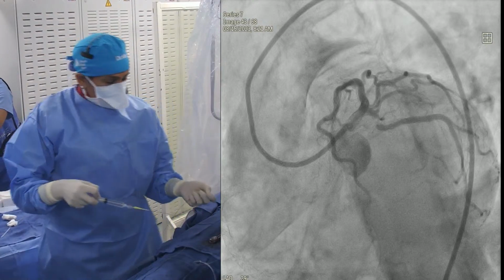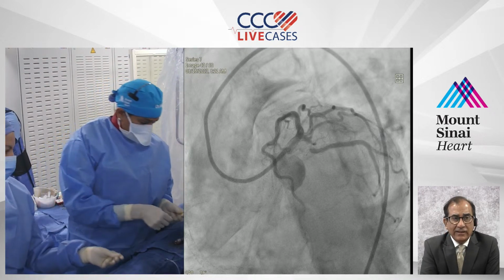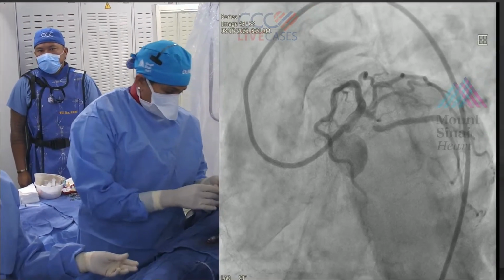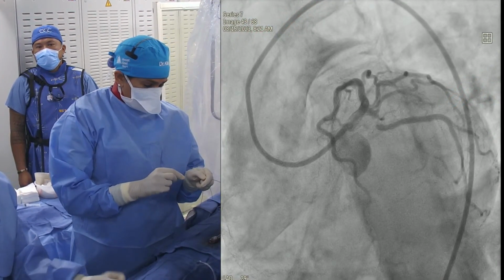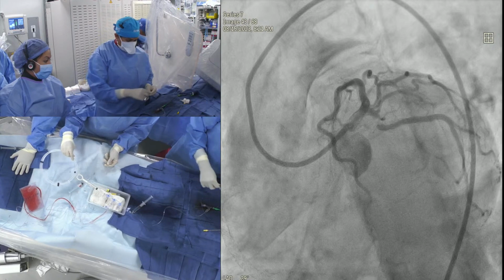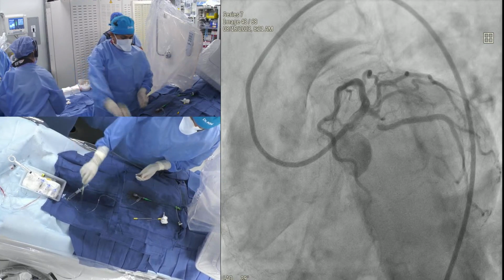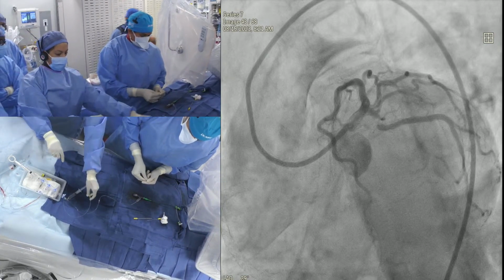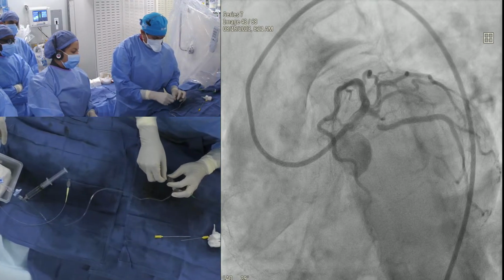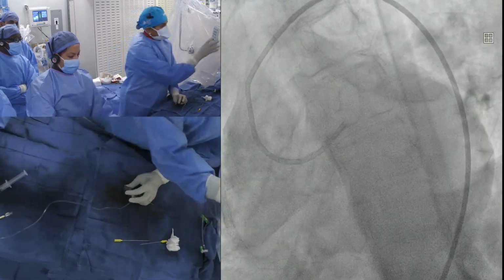Two questions have come in regarding other alternative techniques using either a cutting balloon or orbital. I would say that this is a type of case where there is angulation. Orbital will give you more wire bias and more dissection because the wire is 0.012 compared to 0.009. Second, whether the cutting balloon will make the turn is one of the issues.